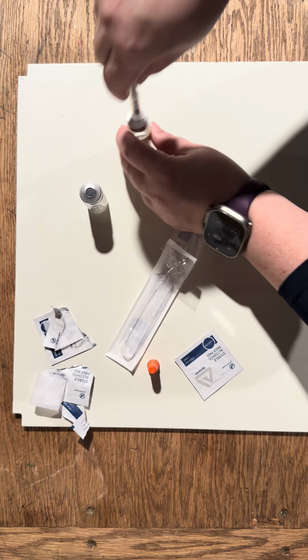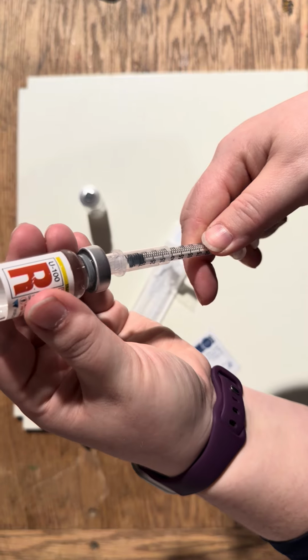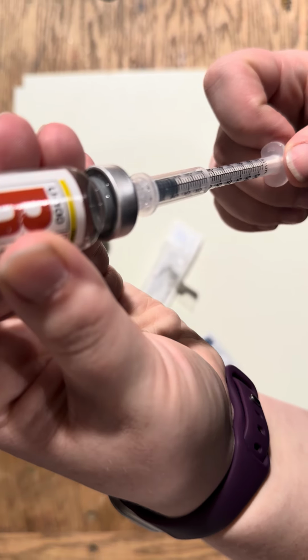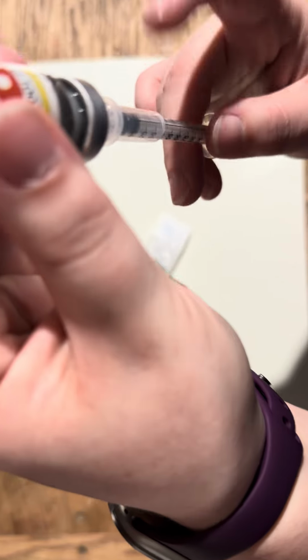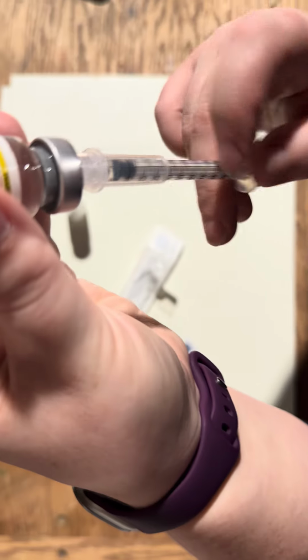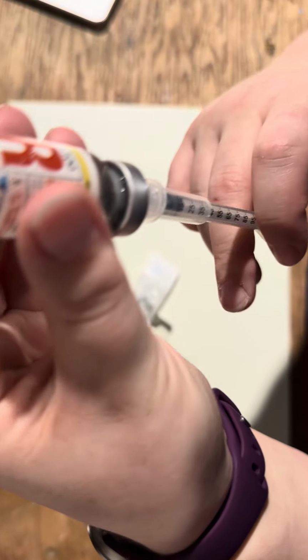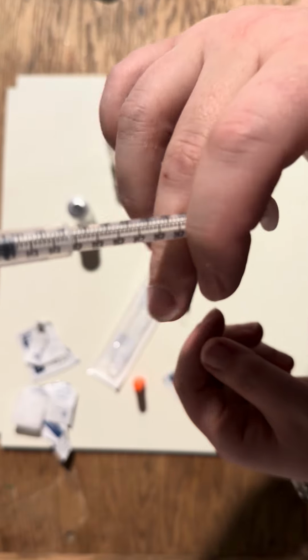I will then flip it, and then pull back to about 8, so I can make sure any air is gone out of my syringe. And then up to 6. It appears that I have no air in my syringe.